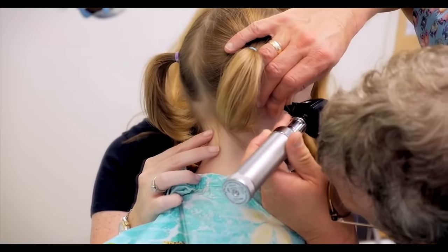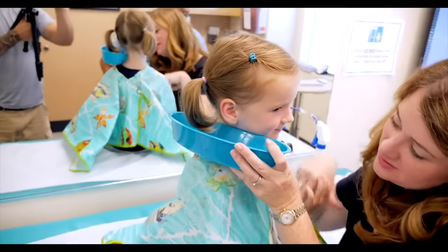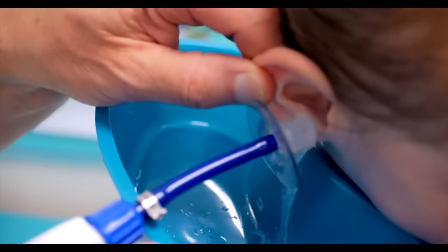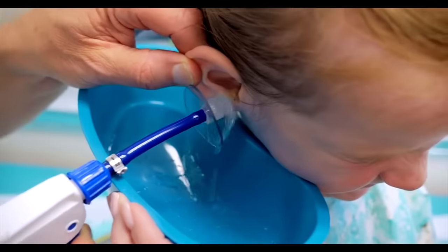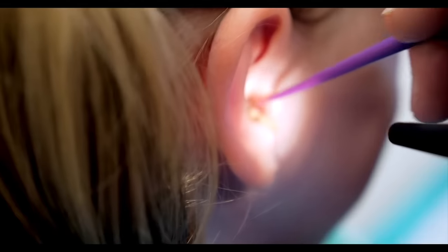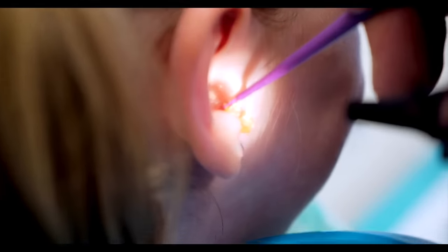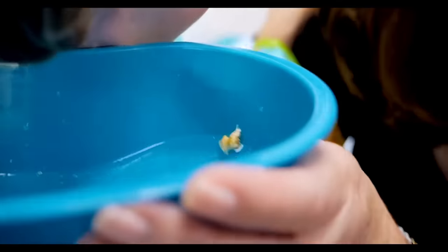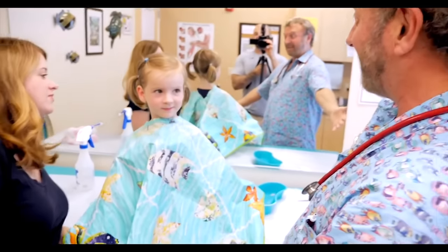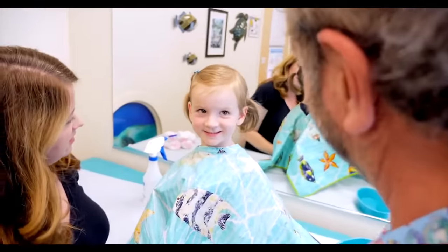I'm going to look one more time — let's see how your ear looks. I can see all the way in now. I'm going to get over to this side. It's just the water. There it is, look at that. Look at that baby — that was easy. Look, it's all right here. There it is. Oh my goodness. You have the cleanest ears in town now.